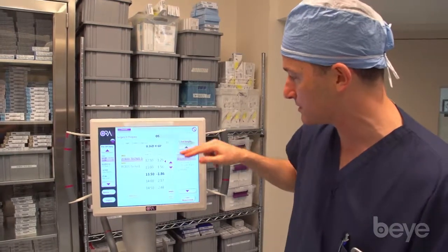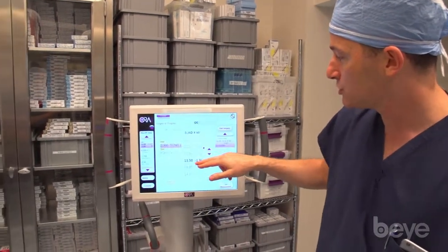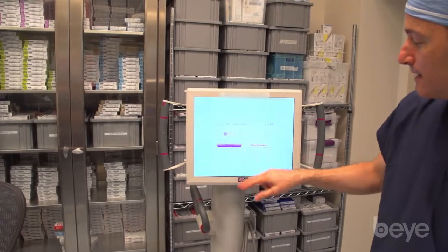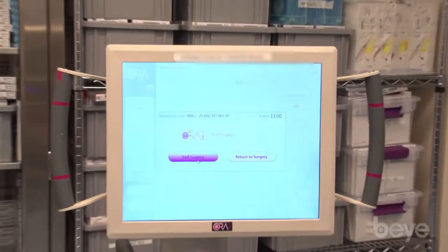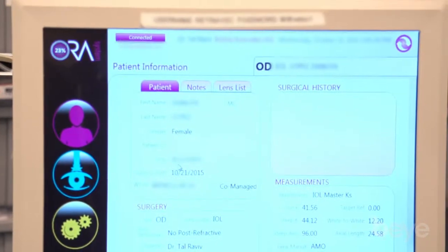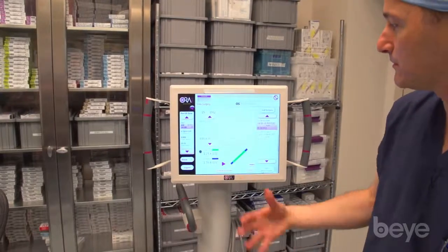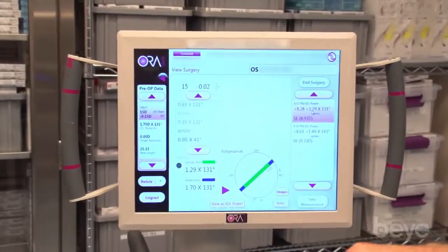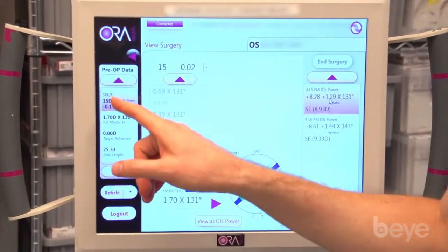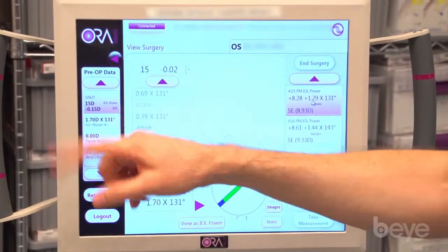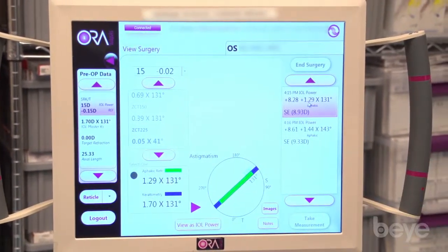One of the most important features is for toric lenses. The Aura has the ability not just to measure the spherical equivalent but also to measure the toricity. Here's a good example of a toric lens case where my initial plan was to place a 15-diopter ZCT 225 lens.